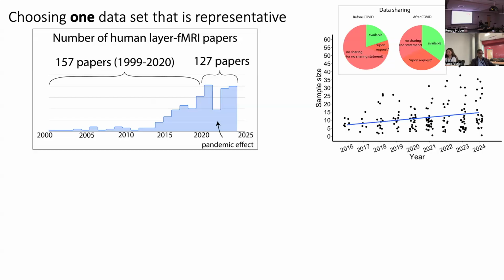Or many data sets. So we need something that's kind of pipelinable, which doesn't really reflect my work at all, right? I'm an acquisition person. I want something that's quick and dirty. I want to finish my scan tonight and look at the layers half an hour later, so I know how to change my task or my acquisition the next morning. So different layer tools are tuned for different things, which is another take-home message I want to bring across to you.